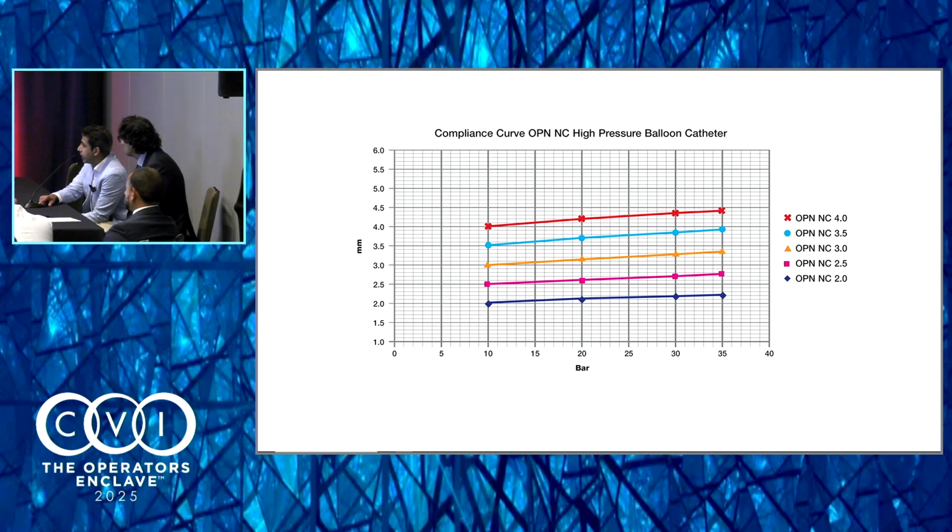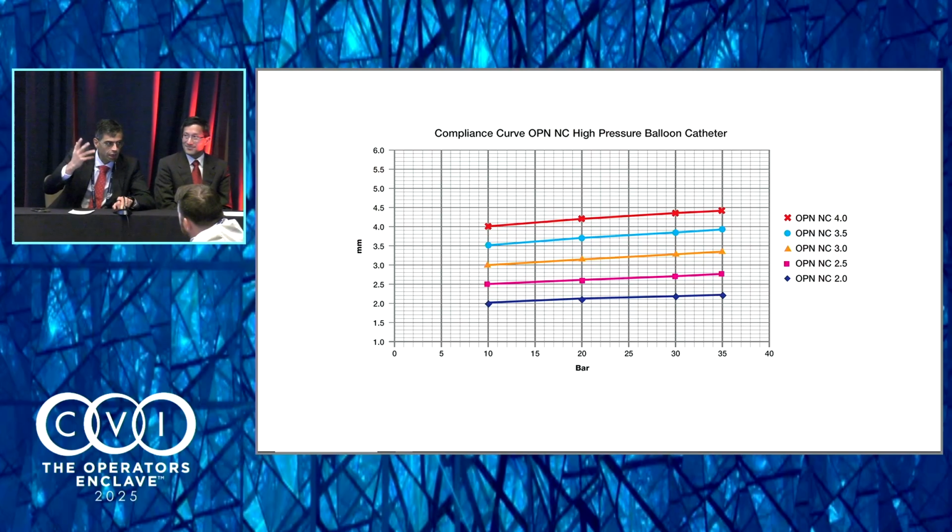Where your area is quite good, you should probably walk away, and you just want a perfect round stent. Perfect. So great talk. Thank you so much. I think we have a couple of minutes, 30-second take-home messages from each of us.